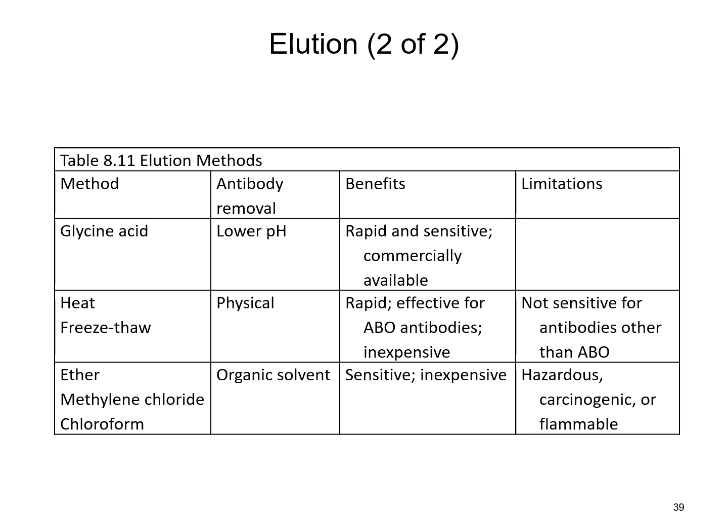Basically what you do is you take those red cells in a little bit of saline, after you've washed them. We do this mostly when looking for hemolytic disease of the newborn, where we're looking to see if the baby's red cells have been coated with mom's anti-A or anti-B.